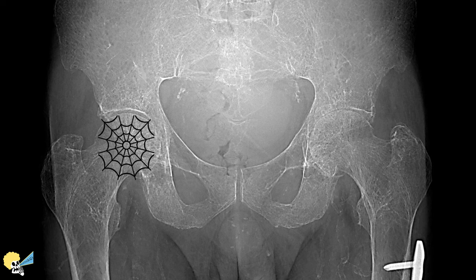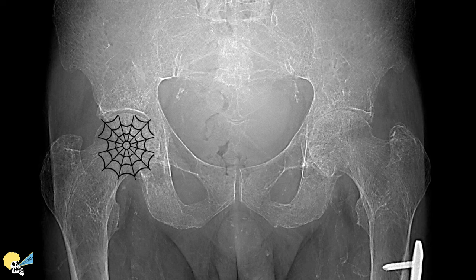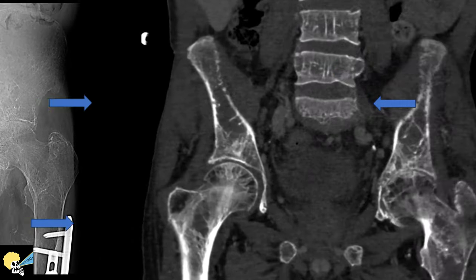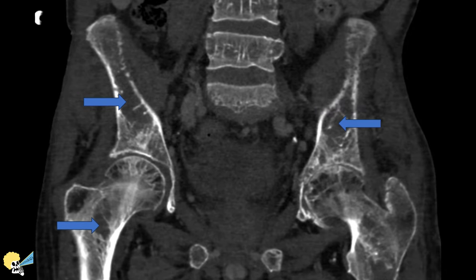In the CT of this patient with thalassemia, we can see large spaces devoid of bone trabeculae, mostly replaced by red marrow reconversion. This absence of trabeculae makes the remaining trabeculae look more prominent, but in reality they are not.